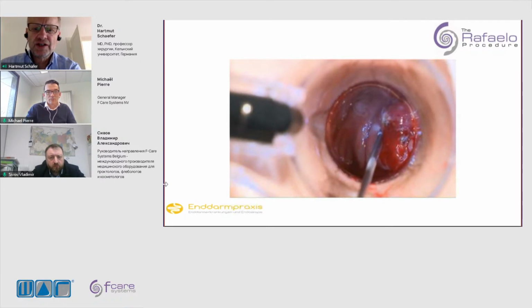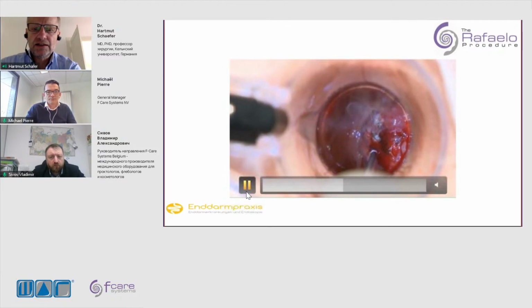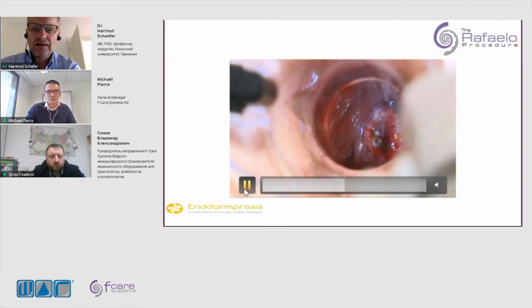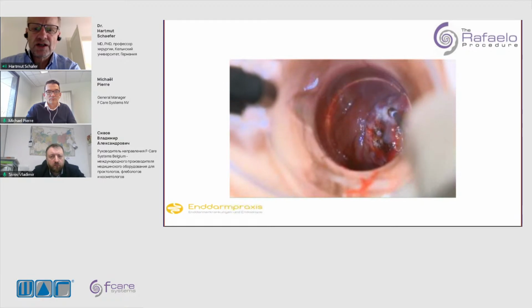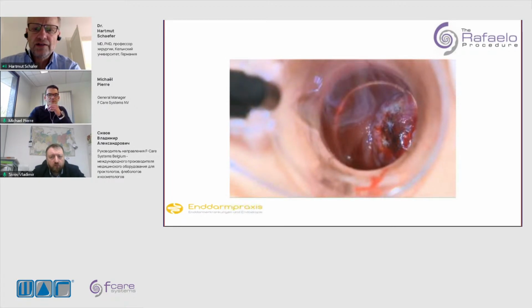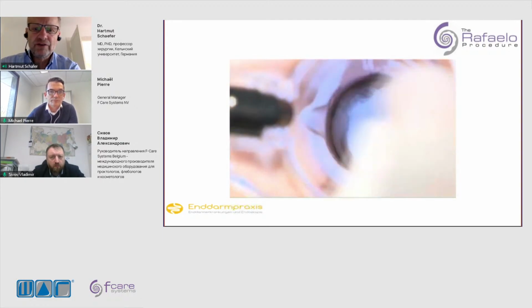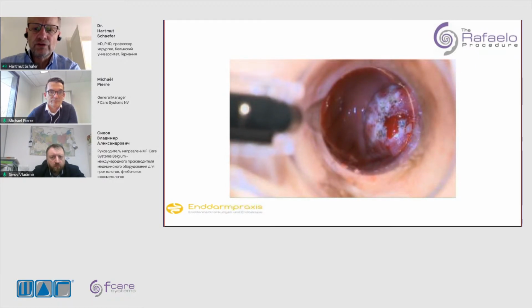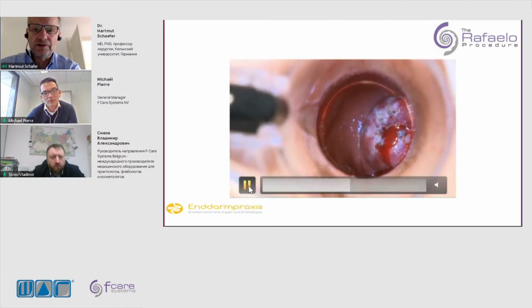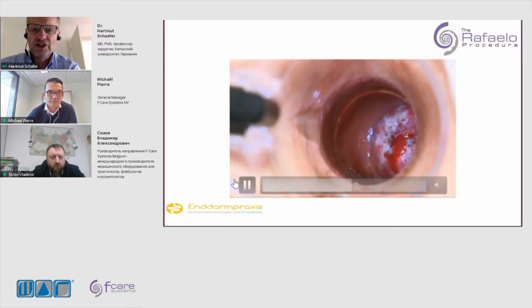Okay, last step of the procedure is the coagulation of the surface with the tip of the probe. Like you see here, the effect of this coagulation is the retraction of the mucosa in order to support a little bit the retraction of the whole node. This is important because if we treat hemorrhoid grade 3, one of the symptoms of the patient was the coming out of the hemorrhoid, and this is what we want to treat. So this is the final picture from this procedure.